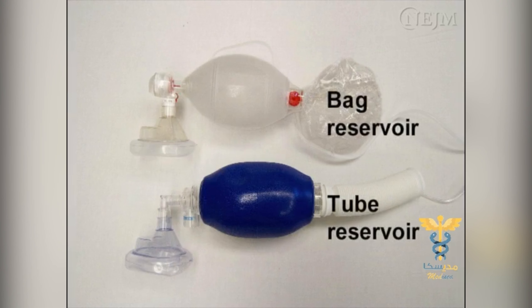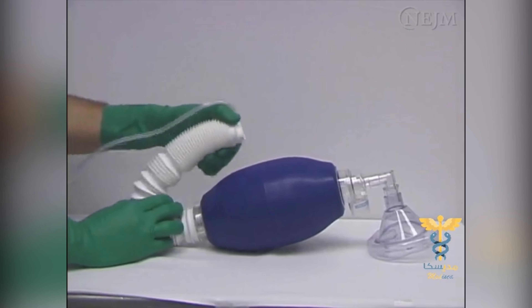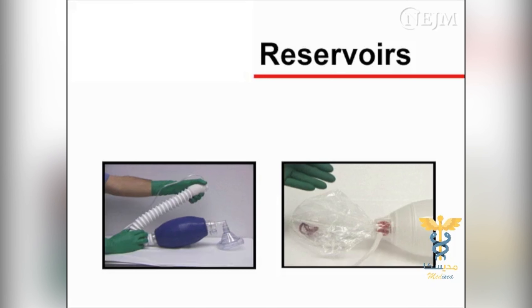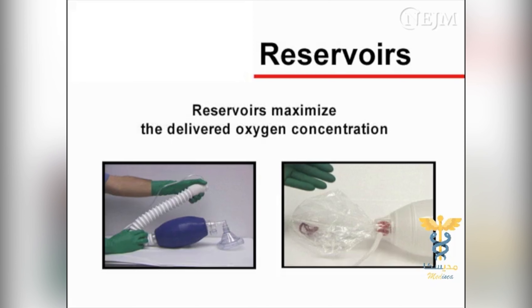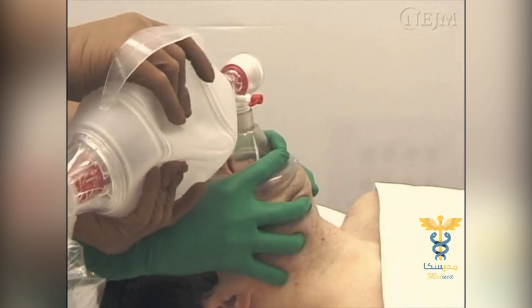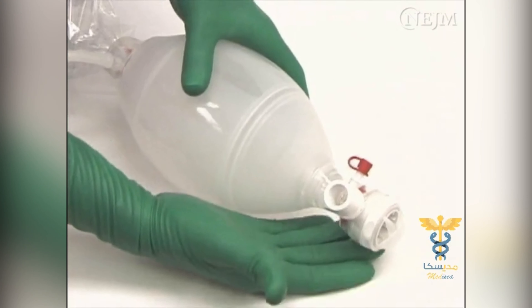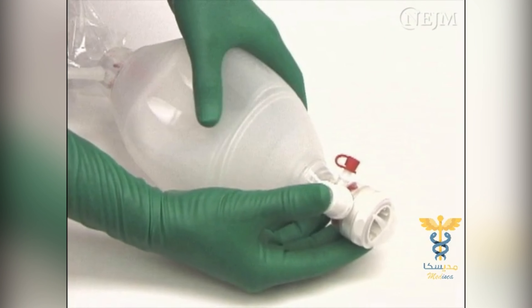There are many types of face masks, varying in design, size, and construction materials. Transparent masks are preferred because they allow for inspection of lip color, condensation, secretions, and vomitus. Face masks consist of three parts: the rim, the body, and the connector. The rim provides the seal with the face. Many masks have an inflatable cushioned rim which creates a better seal with facial contours. Some masks have a malleable body which can be molded to the face, thus reducing dead space. Masks equipped with a ring with hooks can be used with a mask strap to better hold the mask on the face, but may prevent rapid removal of the mask, for example when suctioning the oral cavity is necessary.